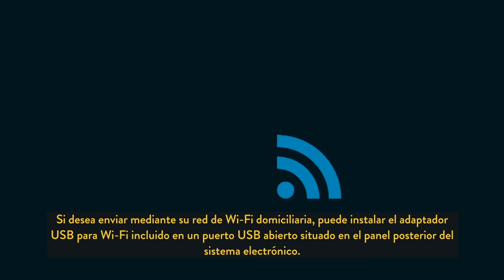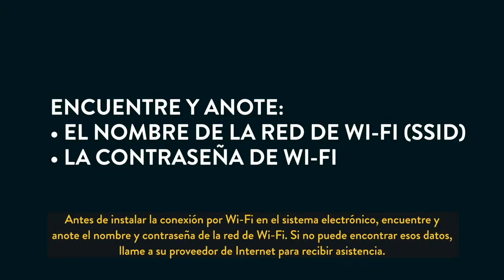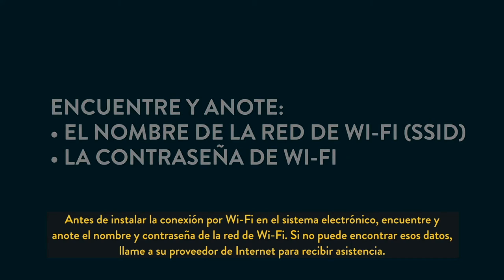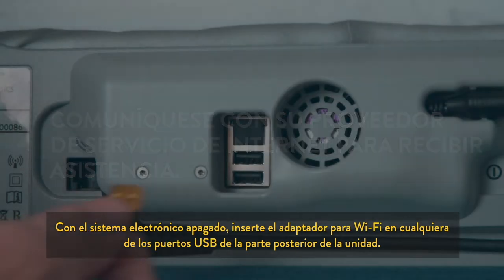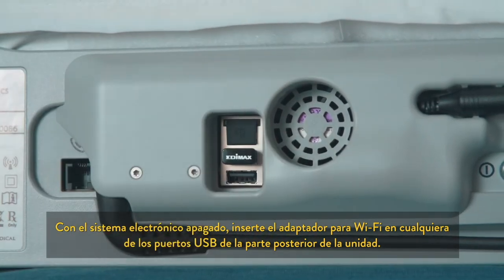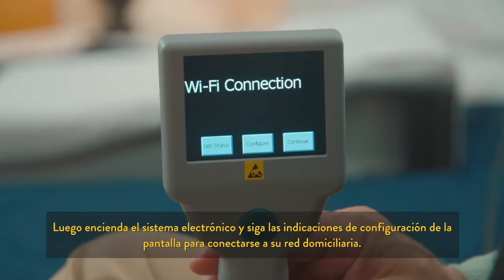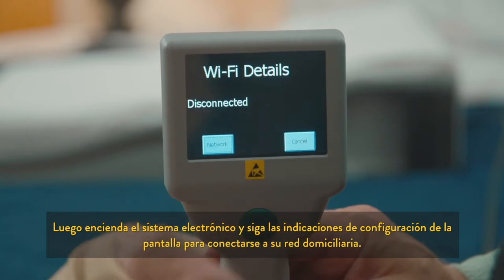If you would like to send readings through a home Wi-Fi network, the included Wi-Fi USB adapter can be installed in an open USB port located on the rear panel of the electronics system. Prior to setting up the Wi-Fi connection, locate and write down your Wi-Fi network name and password. If you cannot find it, call your internet service provider for assistance. While the electronics system is powered off, insert the Wi-Fi adapter into either USB port on the rear of the unit. Turn on your electronics system and follow the on-screen configuration prompts to connect to your home network.